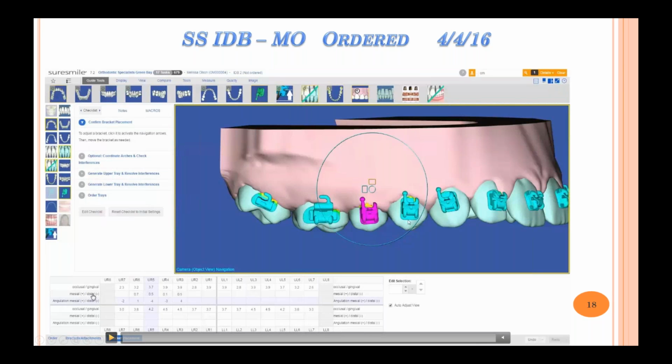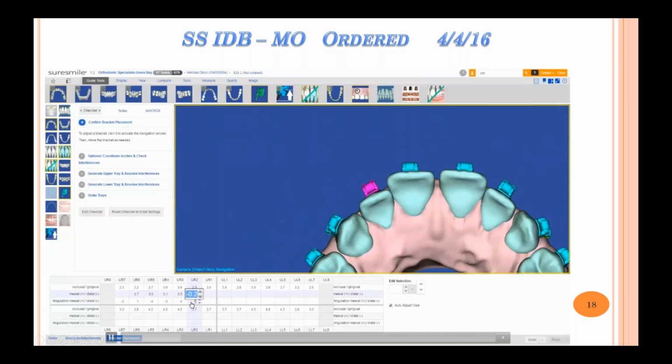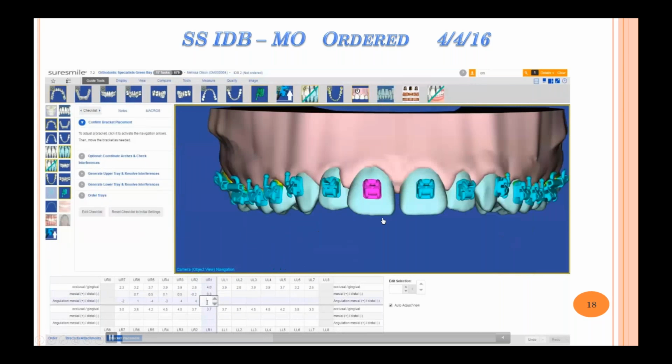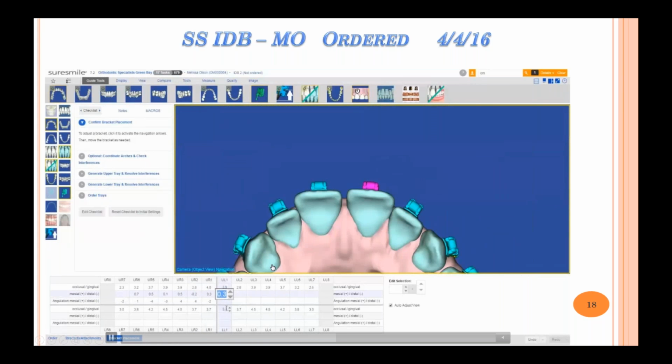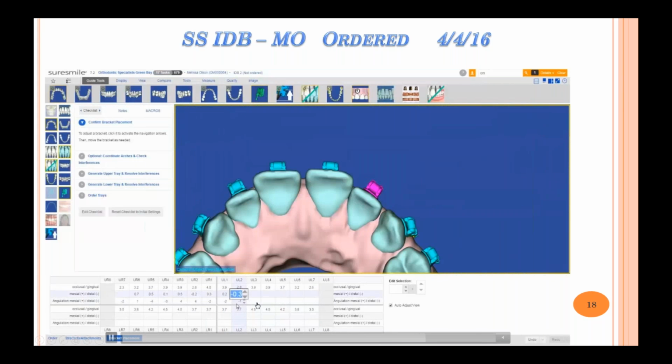We can control things mesial distally as well as angulation mesial and distally with the long axis of the tooth here. All right, and this box here is where I live in, and this is just my way of doing things. And as you see, I'm moving that a little bit more distal, a little bit more mesial angulation. I'm going back and forth, toggling. The software has some preset views so that when you click from one to another angle, it shows you ideally what position you should be in. So it's very efficient. A little bit of mesial angulation there. Okay, so that's just a quick little demo.